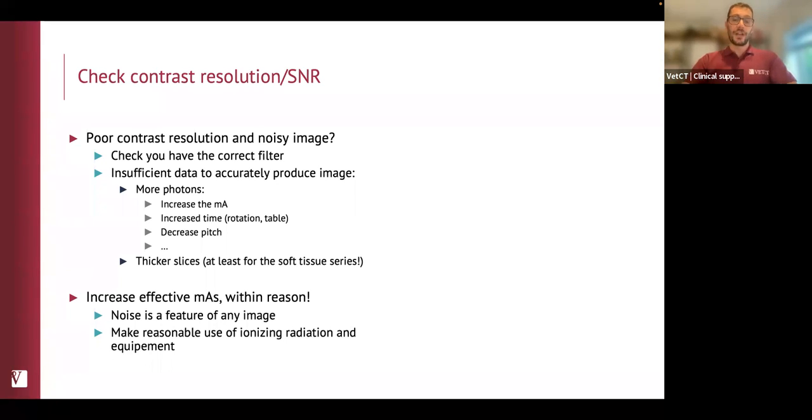And it's also maybe not a very good way to compare, because generally what they are looking for on a CT in humans differs a lot from what we look for in veterinary. Okay, I mean, how often is CT used as an investigation of epilepsy in humans? It's going to go for MRI. But sometimes in animals it's not the option. So we need to maximize and try to retrieve data, which potentially in humans they would just do differently.